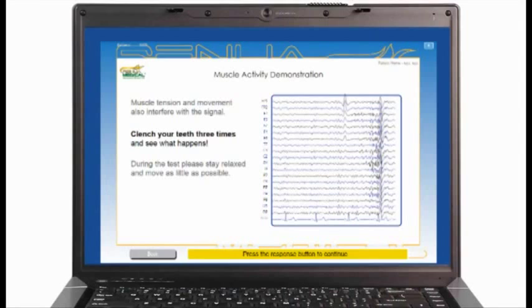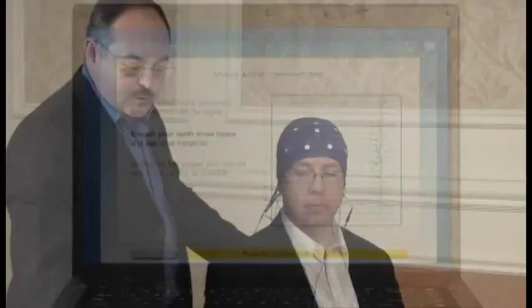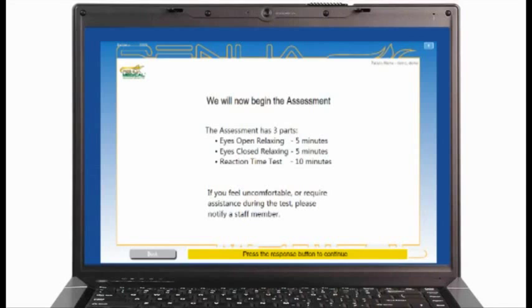Go on to the next screen. This is where you'll clench your teeth three times, following the instructions on the screen. Notice the significant fast wave EEG from EMG that comes when you grit your teeth. You want to try to avoid that during the test. This shows the three parts of the test: eyes open, eyes closed, and the reaction time.